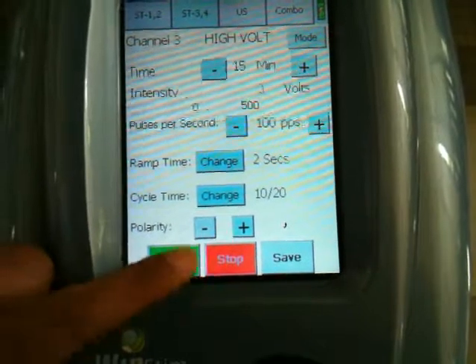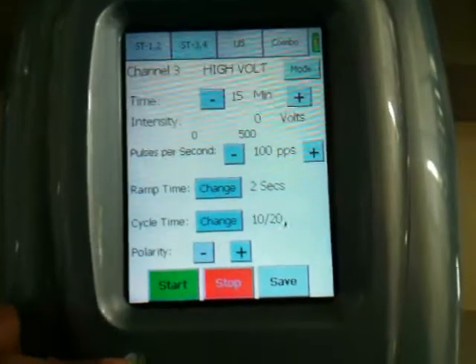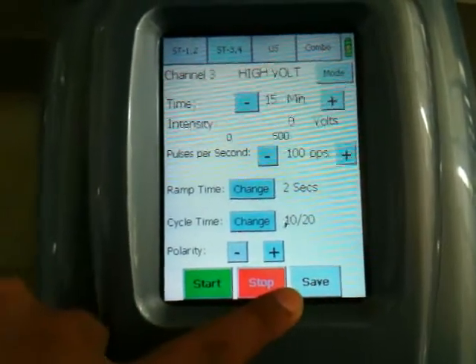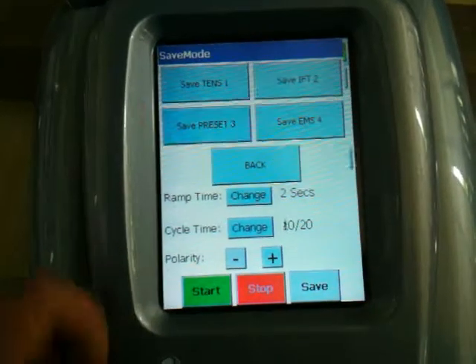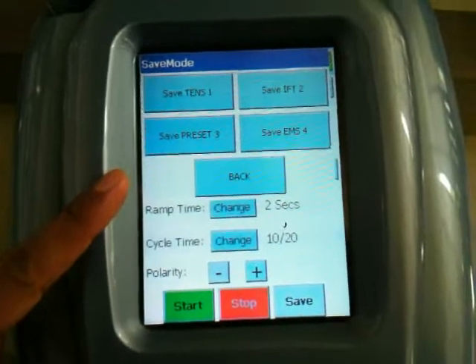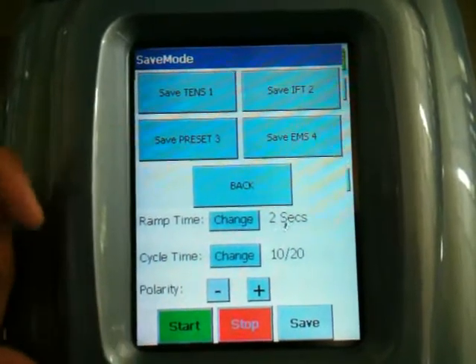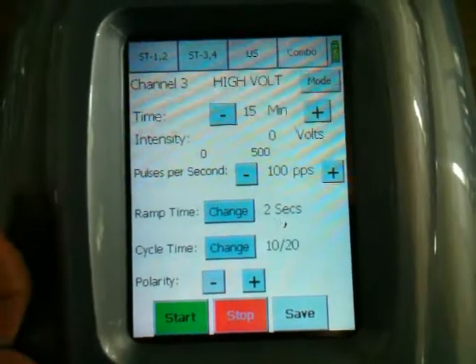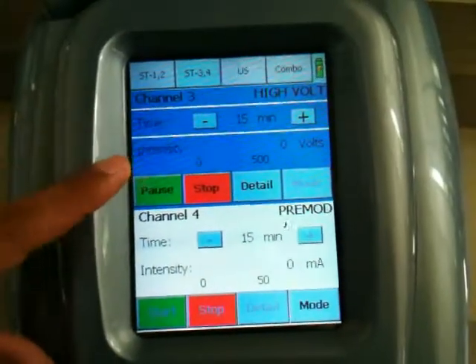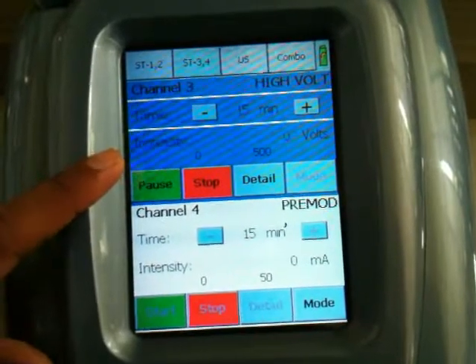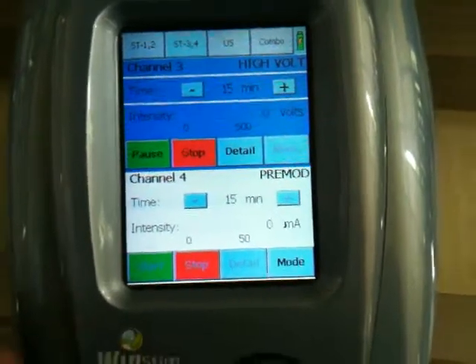Polarity can be selected as positive and negative. We have a save button to store the customized treatment in a memory location. We can save in either of the 4 memory allocations provided in the unit. After saving, we can start the treatment. The blue window will show the active channel and we can increase the intensity through the knob.